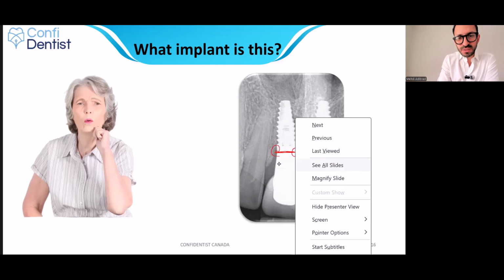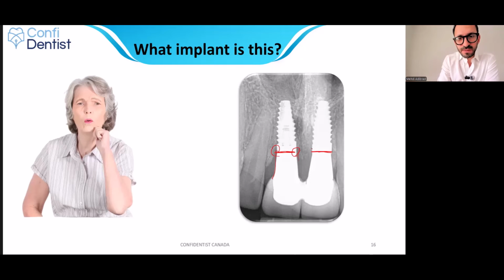You see the prosthetic abutment? It is flush with the implant fixture. There is no step. The crowns are splinted, and there is no evidence of peri-implant bone loss. My bone level here, and bone level here. So two BioHorizons implants with bone level design and no platform switching.